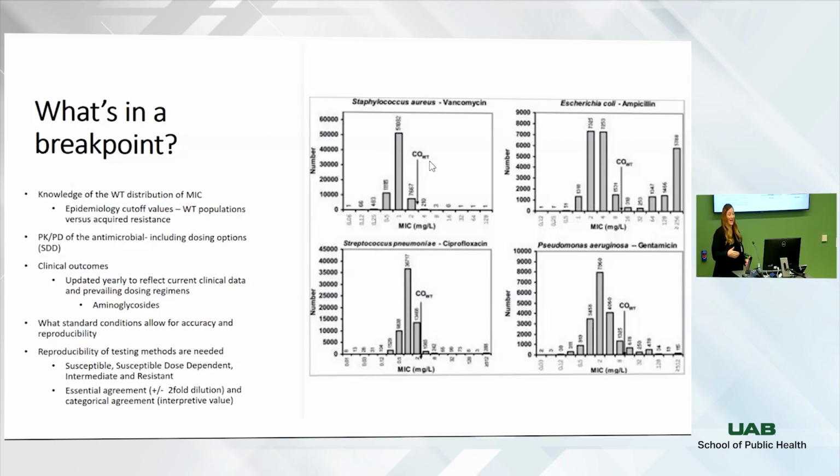So that means that everything is resistant. Our wild type population looks a certain way. We have a nice, beautiful wild type population curve. And generally speaking, if I could get that concentration of drug into a person, it would work. But I can't get that much drug into a person without killing them. So for all intents and purposes, that then is now resistant.